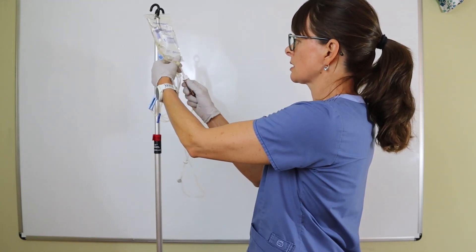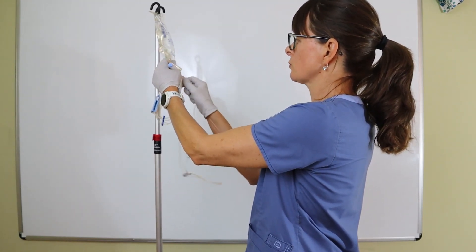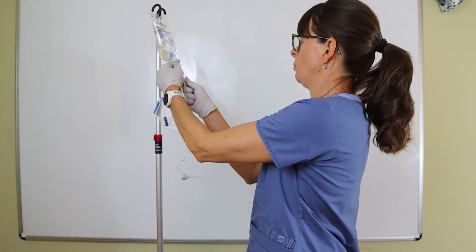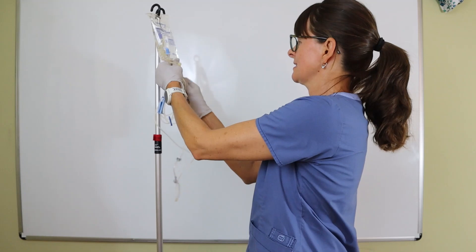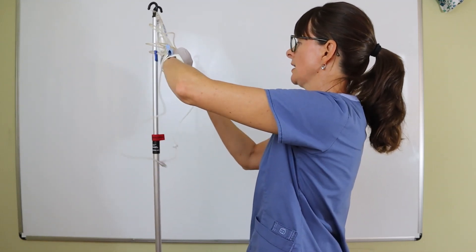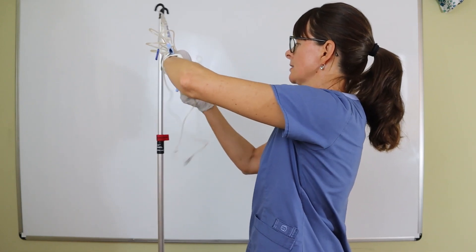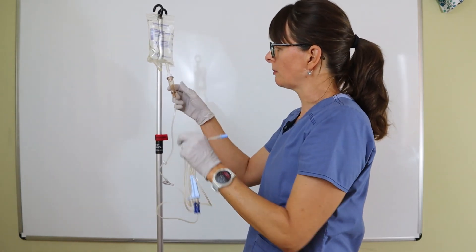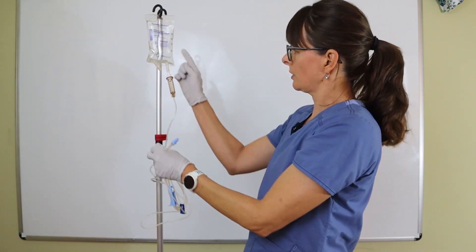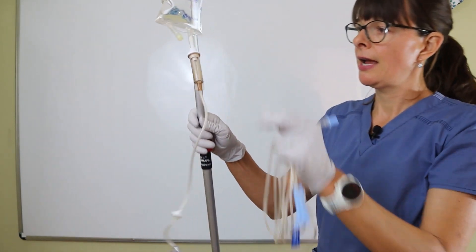Sometimes you just have to twist back and forth to get this to open up. This is not a very easy one to push. Also, I don't want to touch the spiker, the end of the spiker that's going into the IV bag, because I could theoretically carry some bacteria in there.